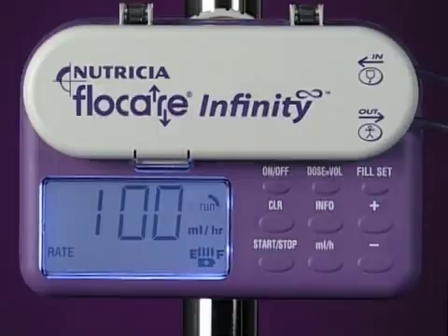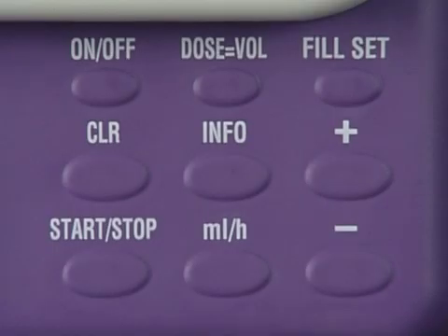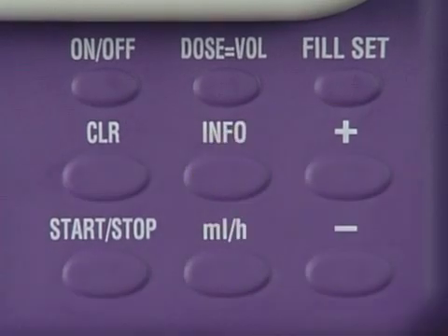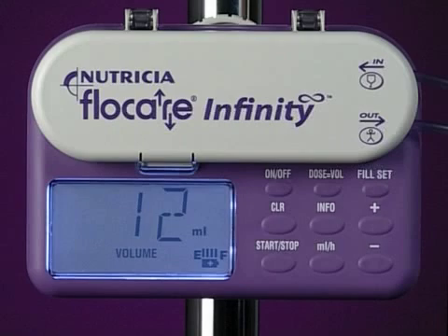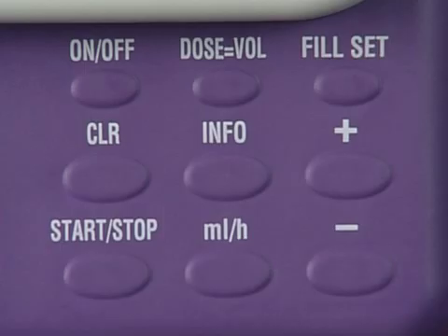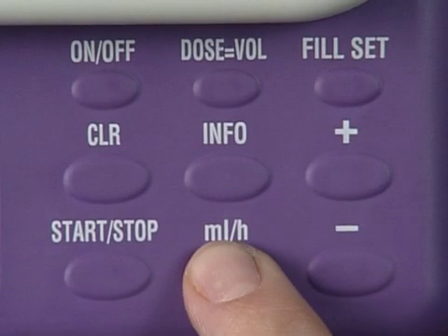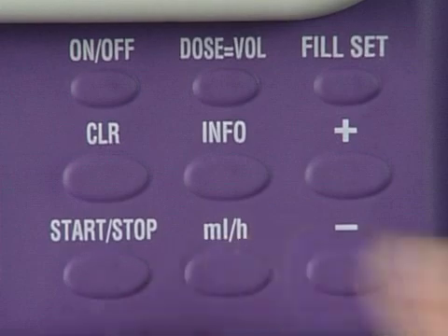The info key can be pressed during operation. It will display the total volume delivered since the memory was last cleared. This information remains in the display until the milliliters per hour or dose equals volume keys are pressed.